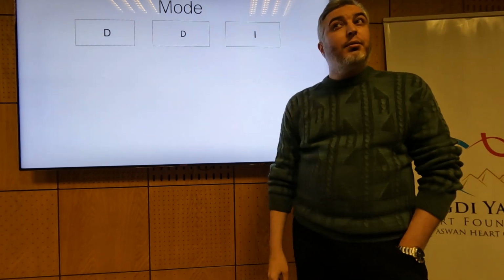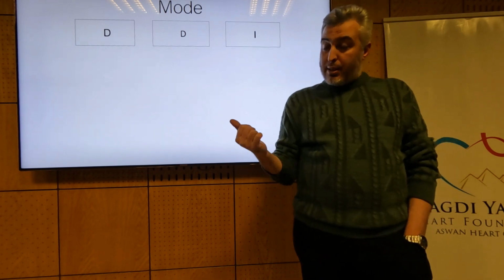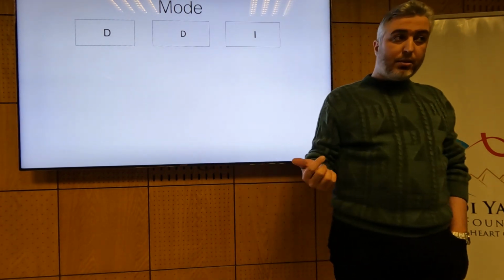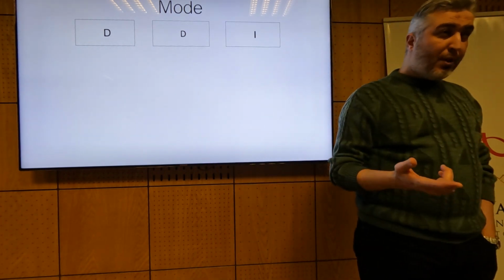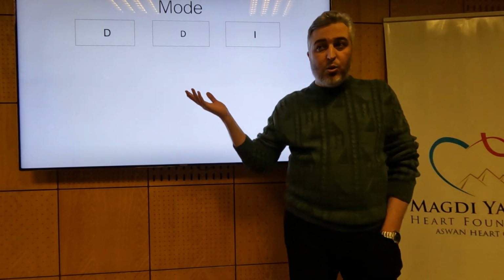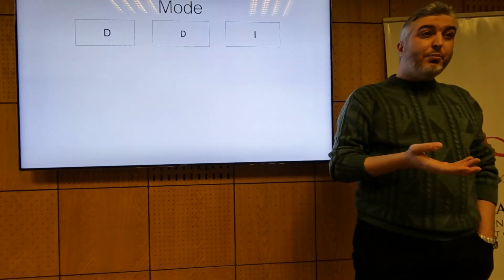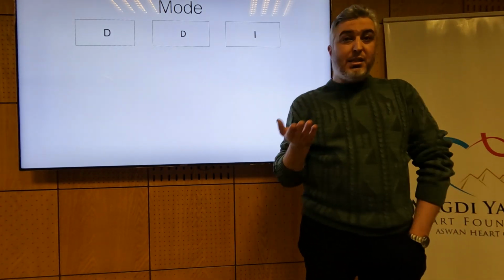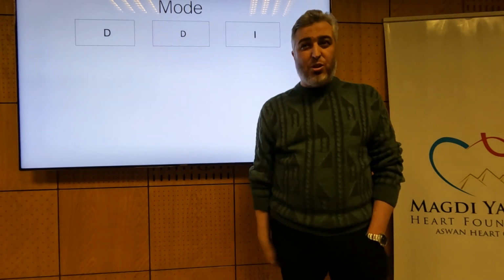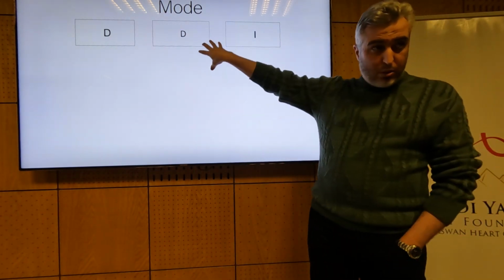Now we notice that actually atrial pacing is very, very beneficial. It's actually useful to increase the heart rate. It is very physiological. It's actually not safe and protective if the patient has heart block or significant atrial arrhythmia. On the other hand, the ventricular pacing is safe, is protective, but very unphysiological. Can you combine both? So let's combine both.